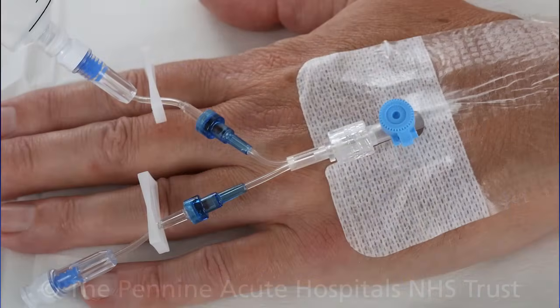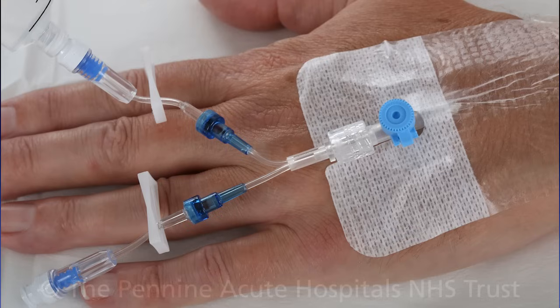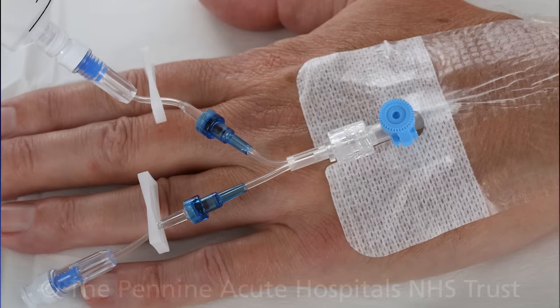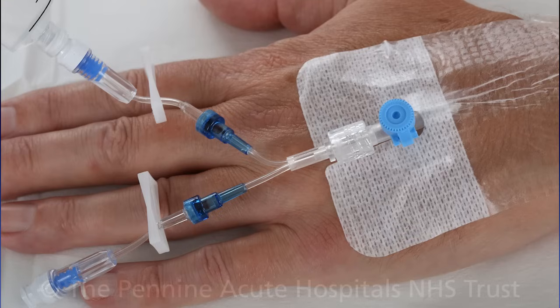A cannula will be inserted into the back of your hand and you will be given a medication through it which will give you a dry mouth.